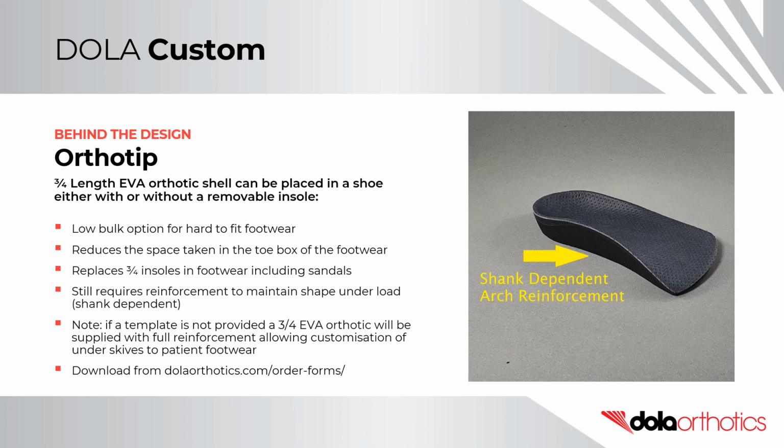Note: if a template is not provided, a 3/4 length EVA orthotic will be supplied with full reinforcement, allowing customization of underskives to the patient footwear.